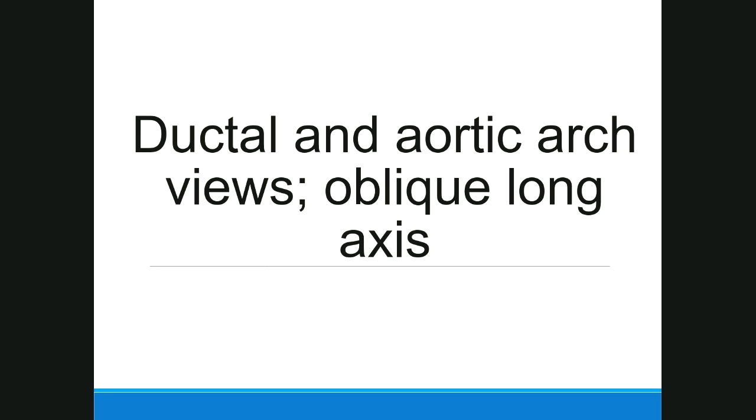All right, so continuing on, we should also obtain images of both the ductal and aortic arches. They're typically an oblique view that has to be used to image these, and you're going to need to get a really good makeshift sagittal slash coronal view to see these.